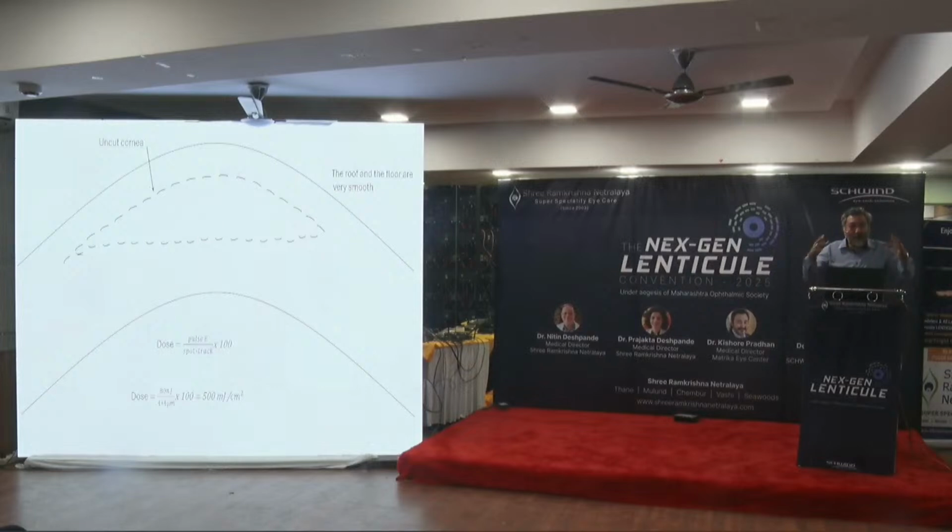So very simple, all doctors, very, very intelligent. What do you need to do now? Bring that closer, right? Very simple. You have got to bring the whole thing closer to each other. So what we did was we reduced the interspot distance. And then we reduced the track distance. Then what happened? It became even worse. See, this is how you all are thinking, right?